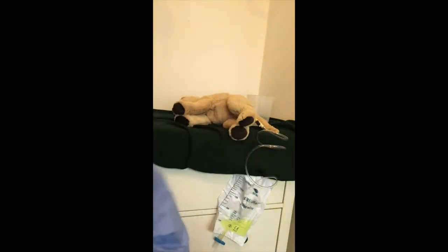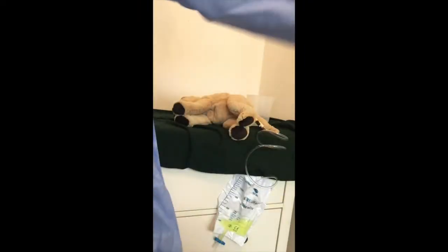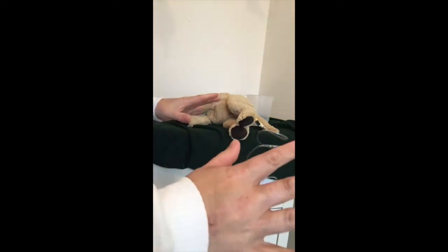So you're going to enter. Chances are the apron will probably be outside, just because there's not much space, so I'm going to put my apron on. I promise you don't have to be sterile, but it's so that you get the picture.